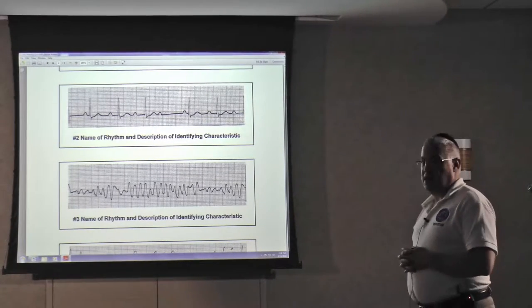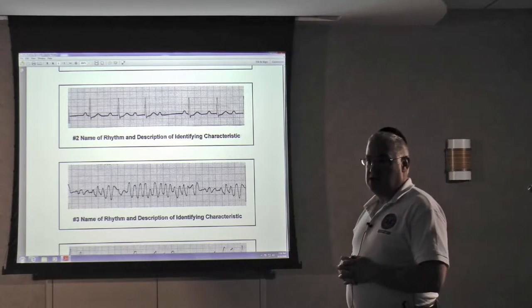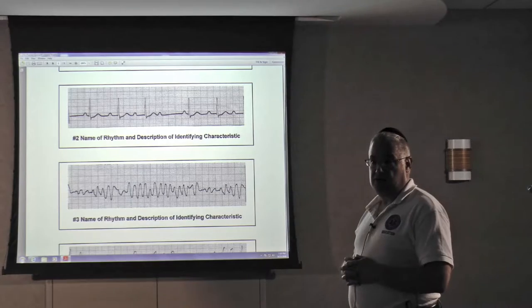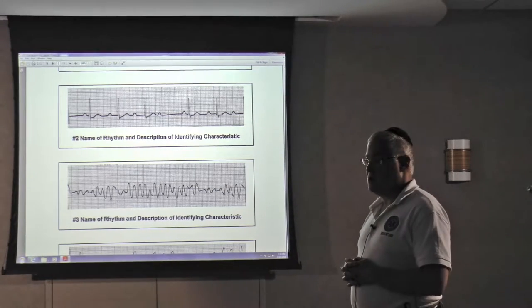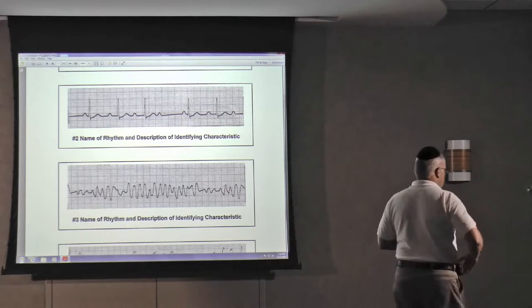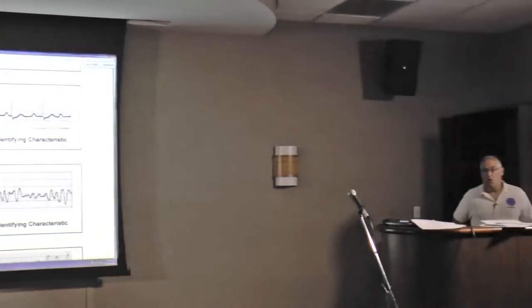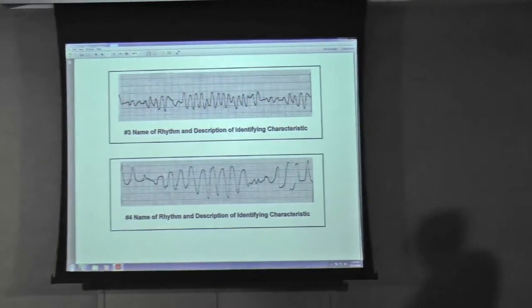Okay, symptomatic, not symptomatic? What do you think if a patient was in this? Usually non-symptomatic, but it depends on how slow the heart rate is, right? So like any bradycardia, if the heart rate's slow enough to affect the cardiac output, the patient can be symptomatic, but usually not. Would the patient even know that they're in this rhythm? Only if they feel the what? The skipped beats. So they may say to you, I feel like my heart's skipping a beat. Okay. Would the patient feel anything in this rhythm? No. Okay. Maybe not. Okay.